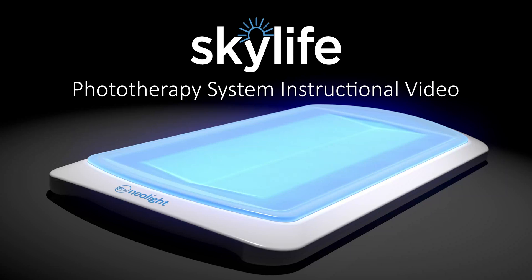Your physician has prescribed the Skylife phototherapy system to treat your baby's jaundice at home. This simple video will quickly explain the steps required to use the Skylife system effectively.